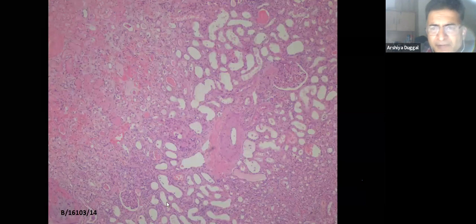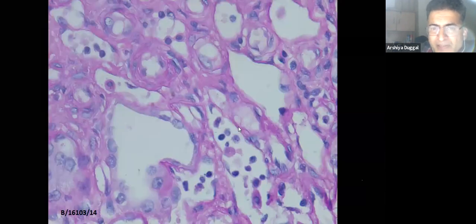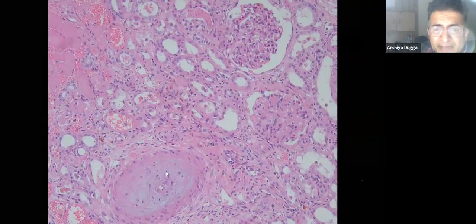The graft nephrectomy showed all the classical findings that you see in antibody mediated rejection. You can appreciate the vessels, which were very thick. I'll show you here. In the graft nephrectomy, we appreciated a lot of microvascular inflammation, and a lot of cells in the peritubular capillaries. These are the PTCs. There was significant peritubular capillaritis, but it was not visible in the initial three biopsies which I have shown you, and it affected mostly the vessels.